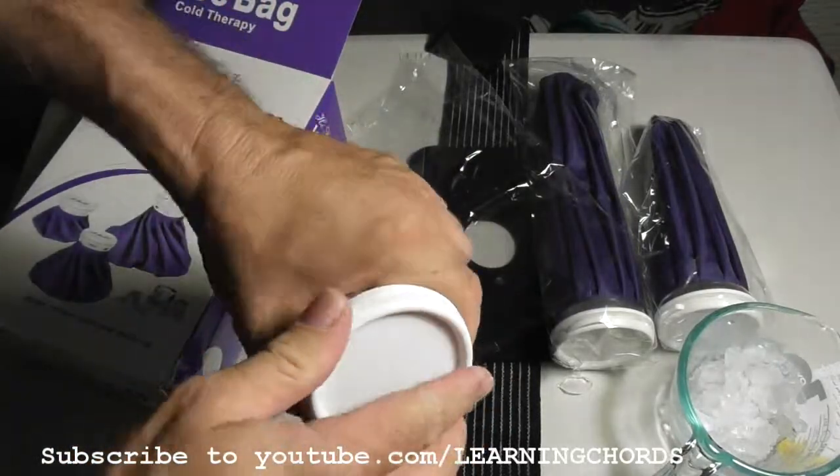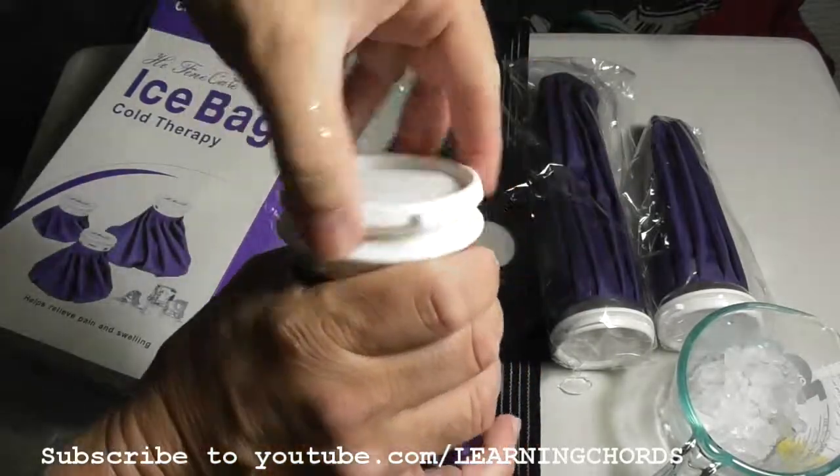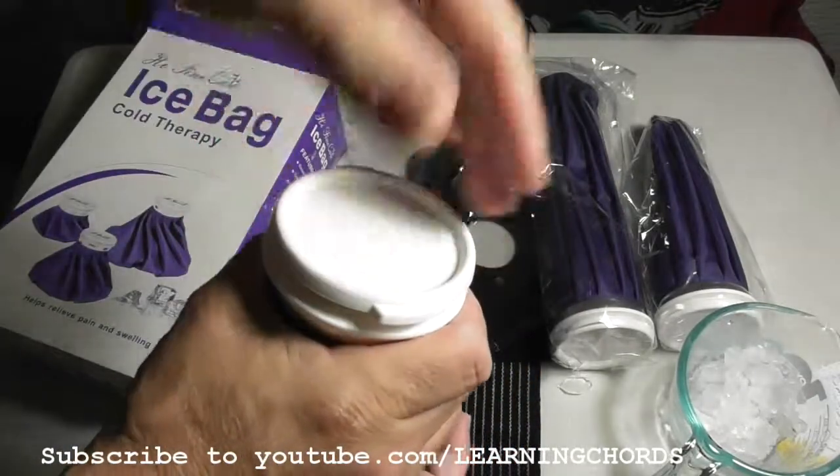The price is very reasonable. It's a really tight cap, and they're so easy to close and to open.